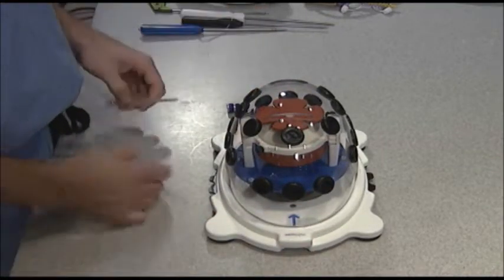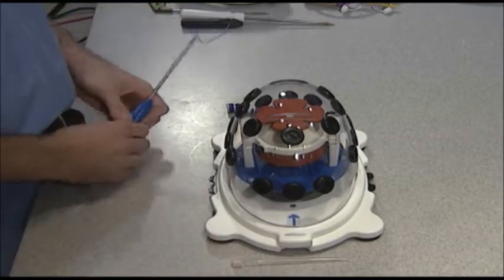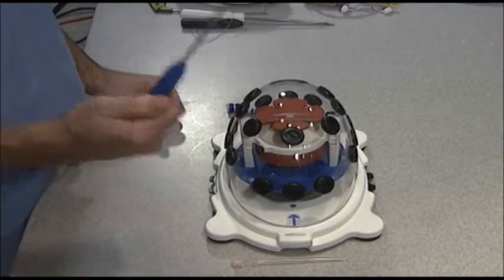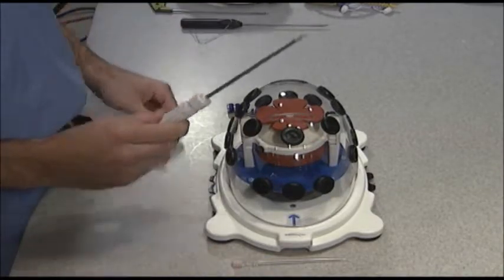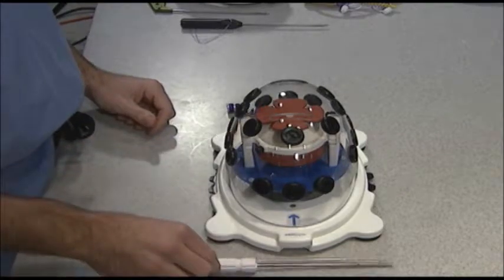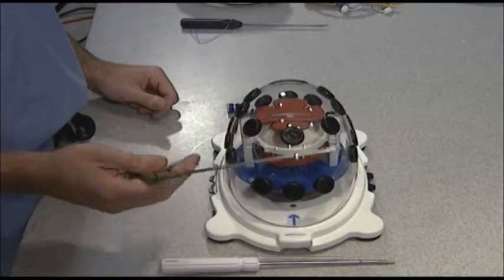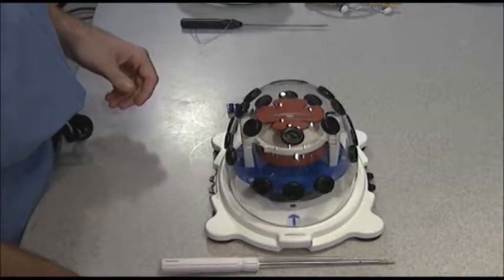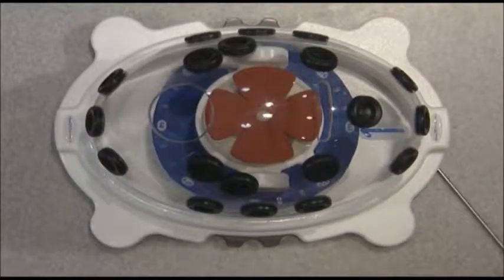The instruments or tools that you'll need for this task is a 18 gauge needle. If you're going to use an anchor which requires a punch, you'll need a punch. And then you'll need some sort of suture anchor, and then a ring grasper or another tool to be able to grasp sutures. We're going to talk about the task of anchor placement.